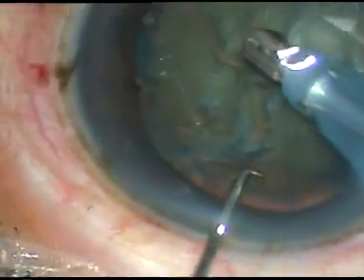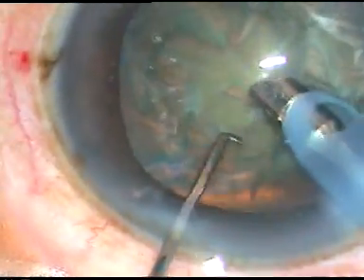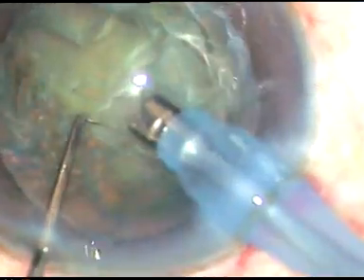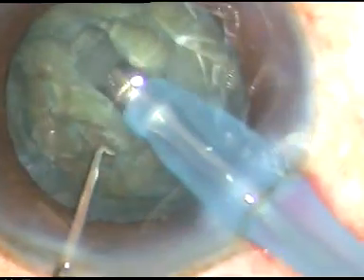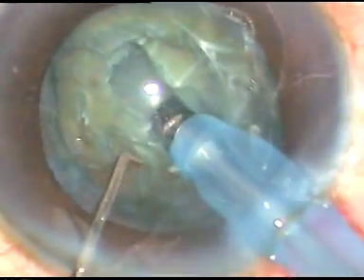Now the tip of the phaco handpiece is introduced into the chamber. In this case I want to show stop and chop. I'm sculpting in phaco two mode, but beginners should do it in phaco one mode.